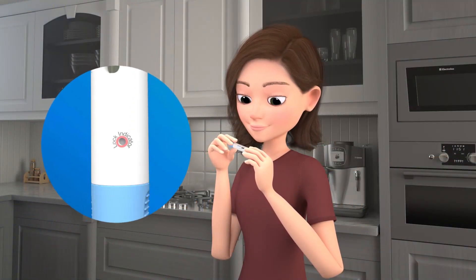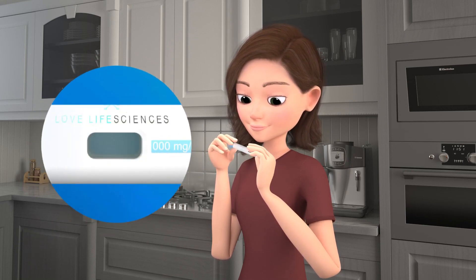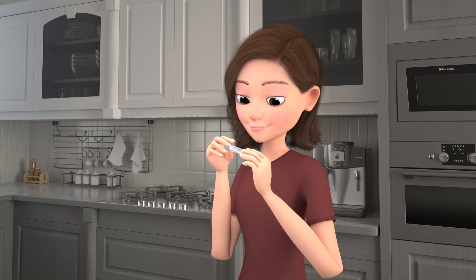Look at the lock indicator to ensure that it is not red, indicating that the UniPen has already been used or locked. Look at the medication window to ensure the medication is the proper color. And finally, look to confirm the device is not expired.